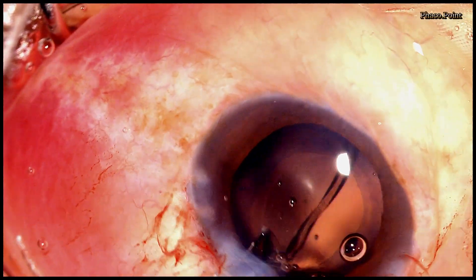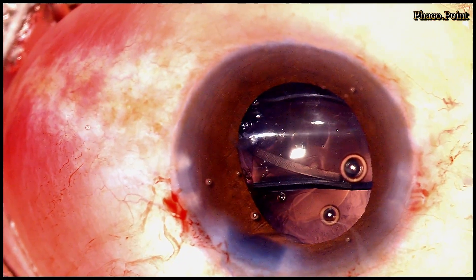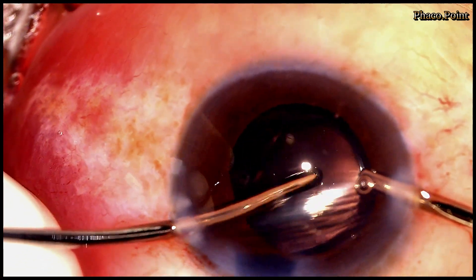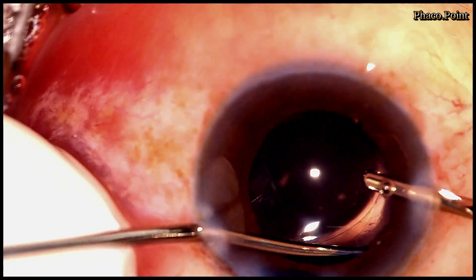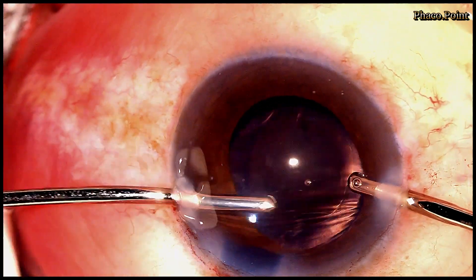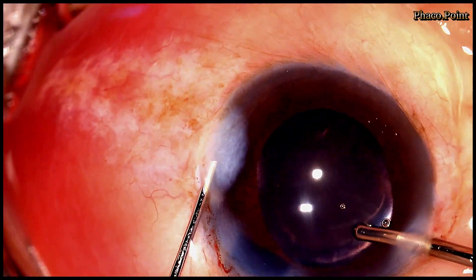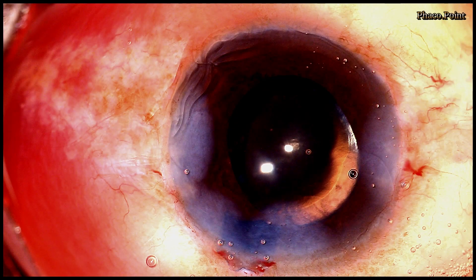This is followed by the introduction of the single-piece monofocal IOL in the capsular bag. As always, the excess viscoelastic is removed from the anterior chamber and from around the IOL. The wounds are then hydrated, bringing us to the end of the second case. I hope you found this video tutorial analyzing the differences in the management of intumescent cataract in both a young and an old patient useful. Thank you!